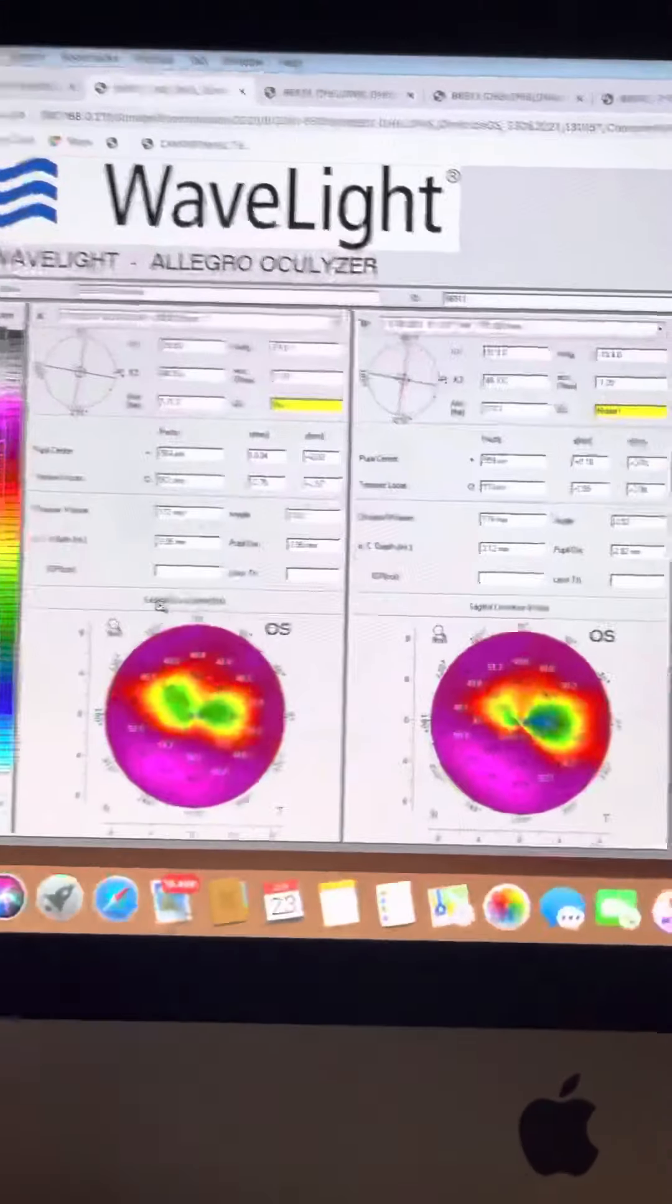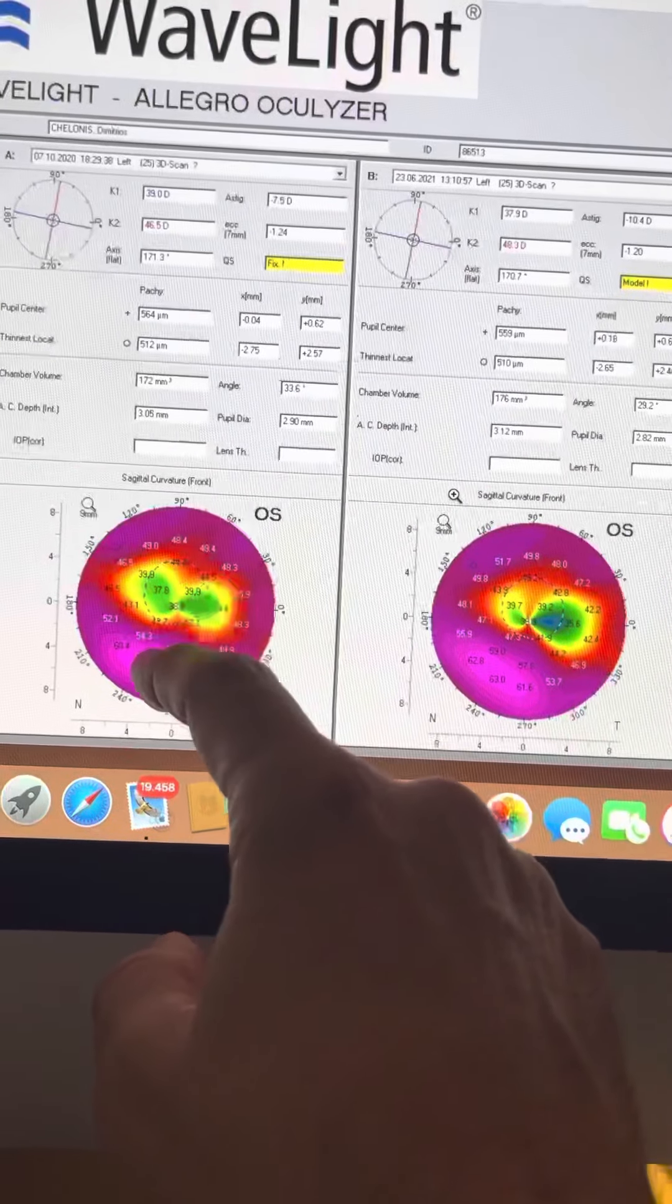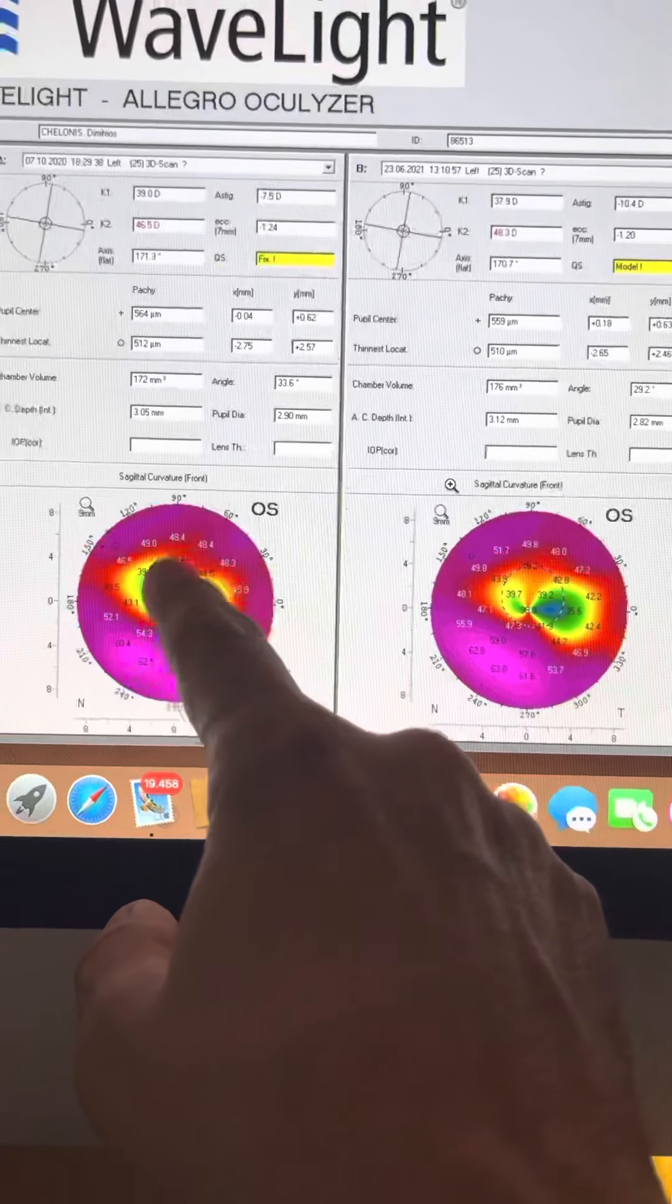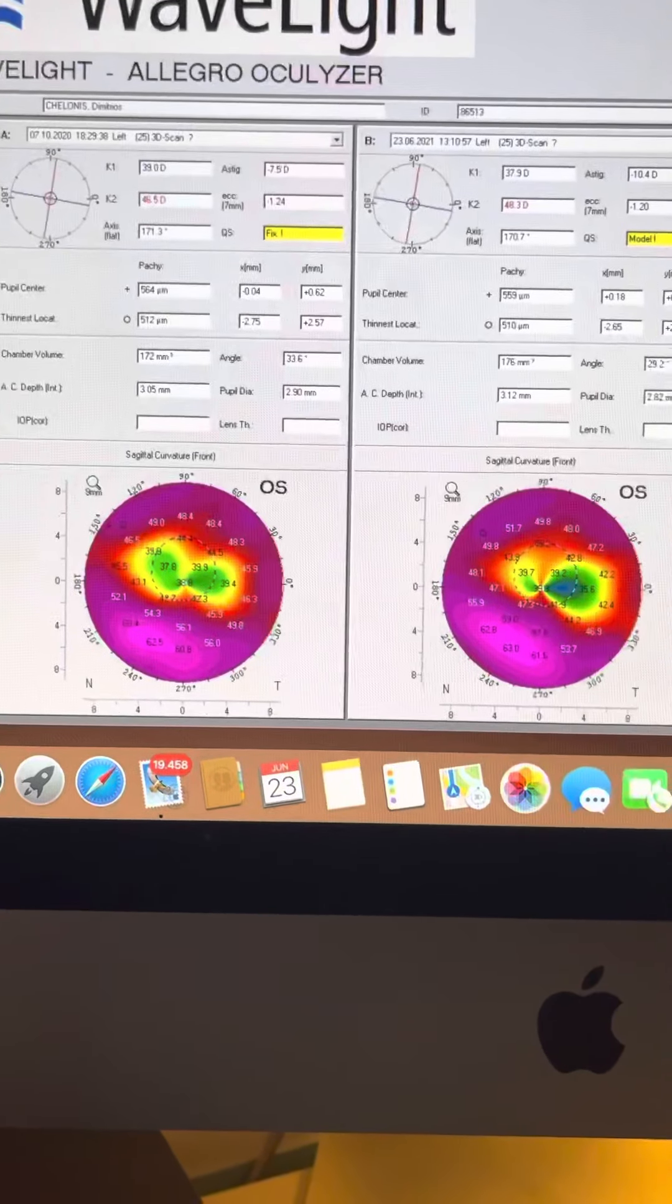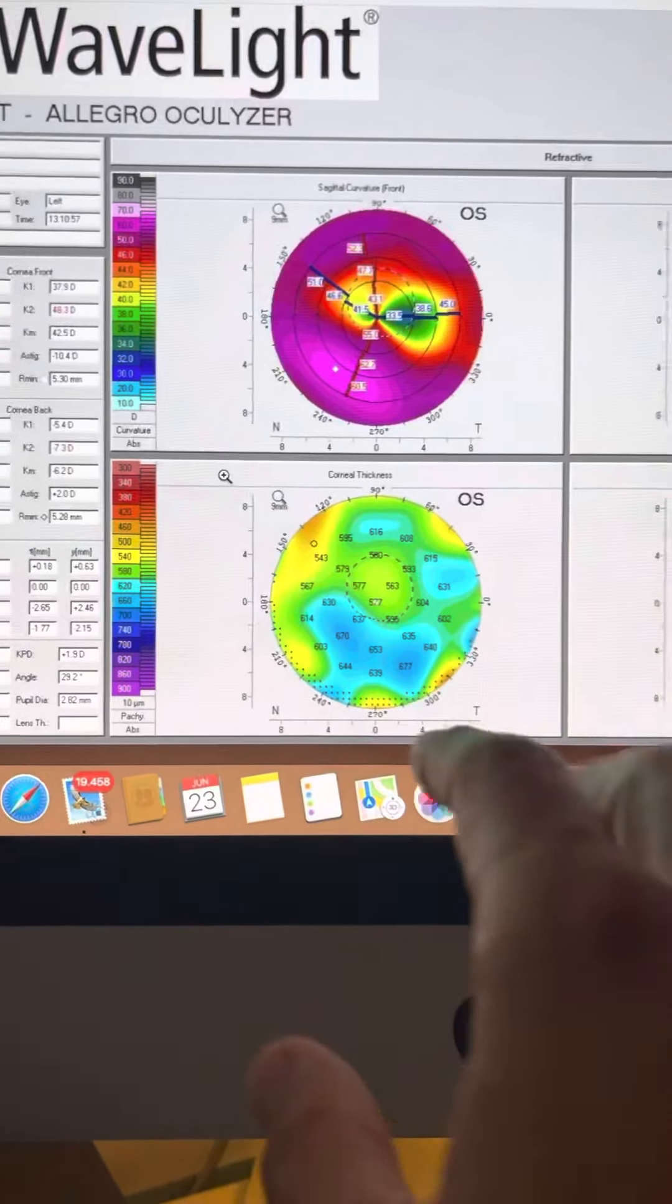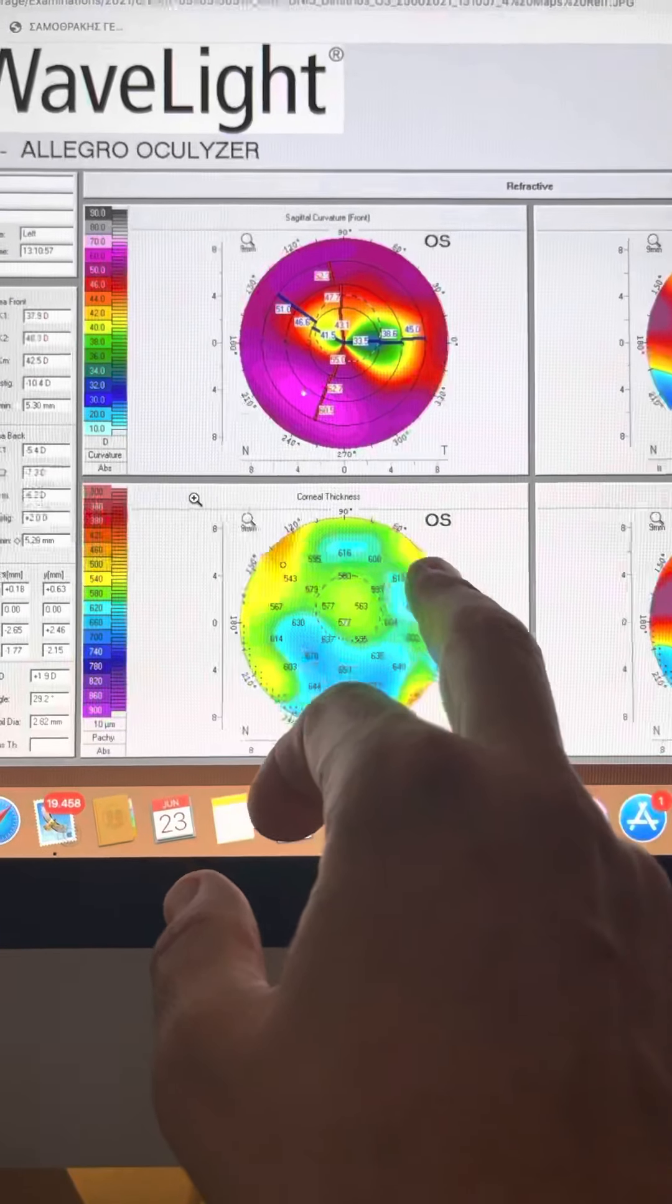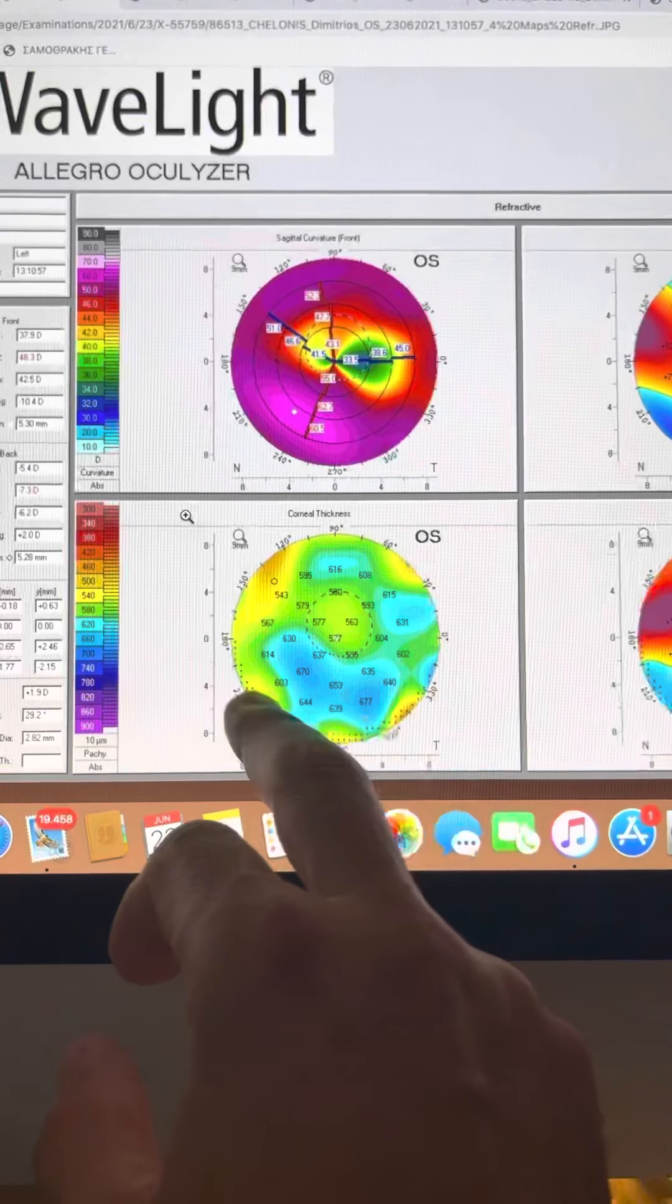And the problem here, as we'll see in the comparison pentacam maps, is that he has significant, almost 7.5 diopters of with-the-rule astigmatism. And if we look at the pachymetry maps with the pentacam, this is not dependent on the graft host interface being thin.